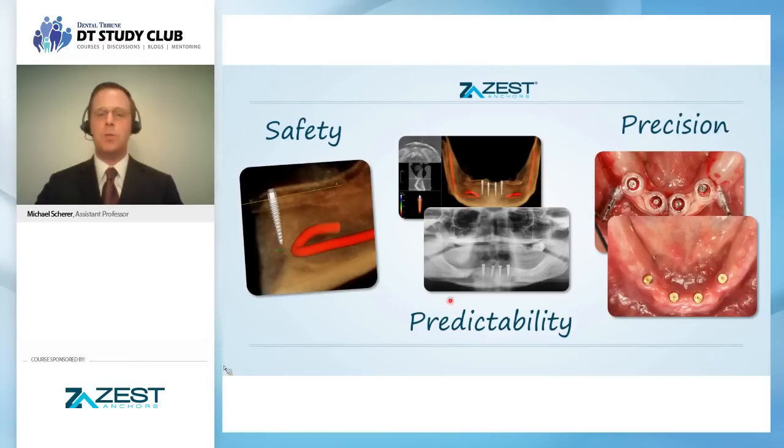It's absolutely huge, because when we go from our plan to our final result, we know that if I get close to a vital structure like this anterior loop of the foramen, I've got a really predictable clinical situation. Because as I try to do things like this where I'm going to maximize the spread of my Zest LODI implants, you can very straightforwardly achieve this clinical goal.